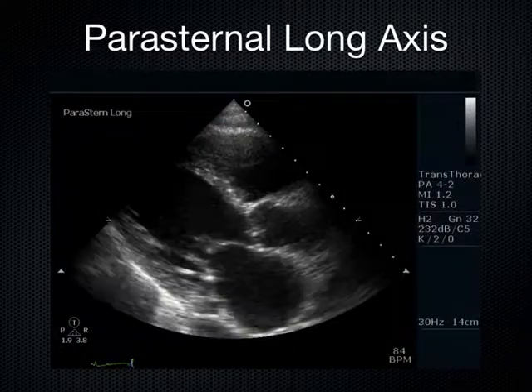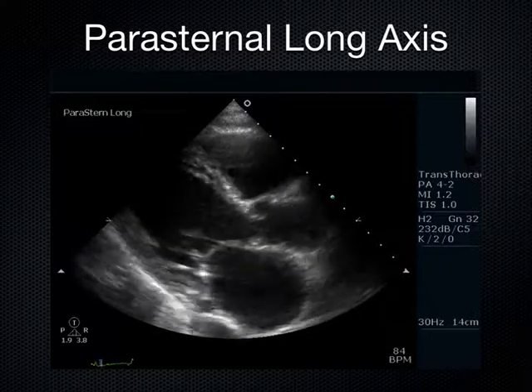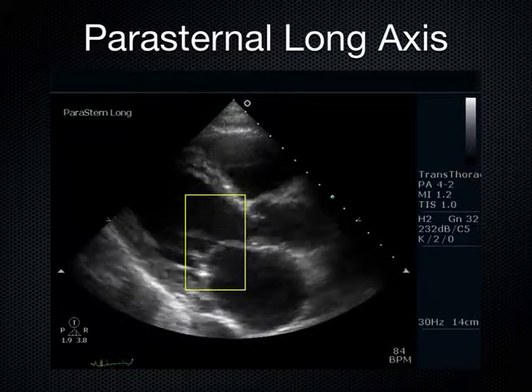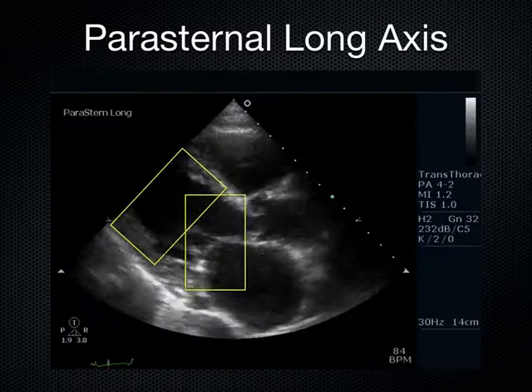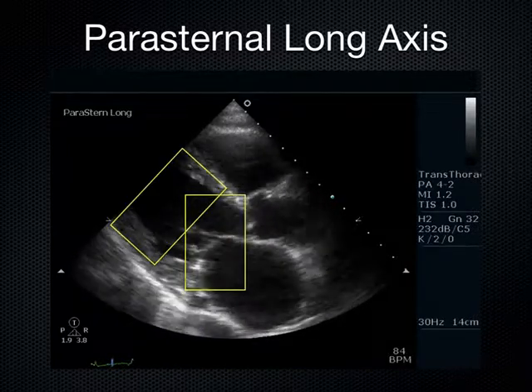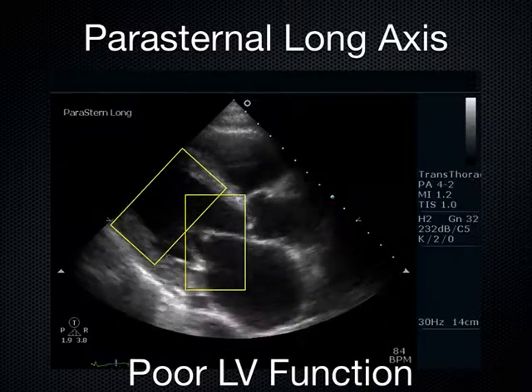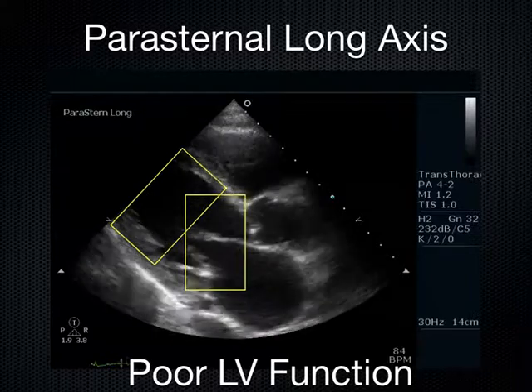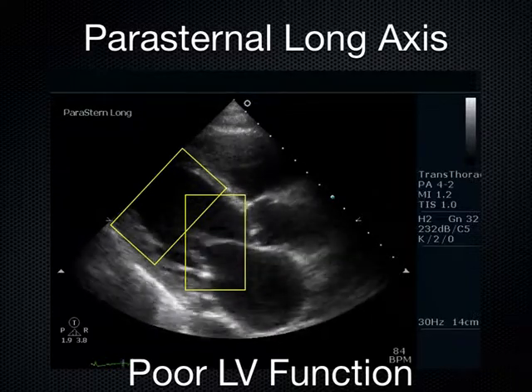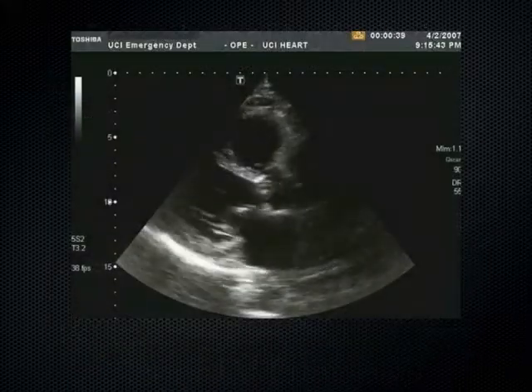How about this one here? Medications or fluids? Medications, exactly right. See that mitral valve there? Not really doing much towards the septum. And we come back there, we look at that septum and that posterior wall, not doing a lot for me either. Not a lot of delta in that chamber size between end systole and end diastole. You guys think about this.